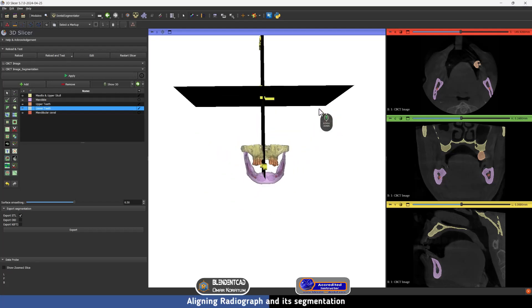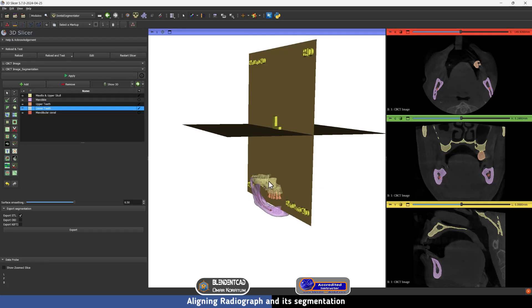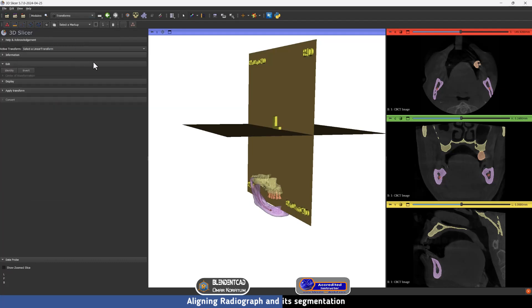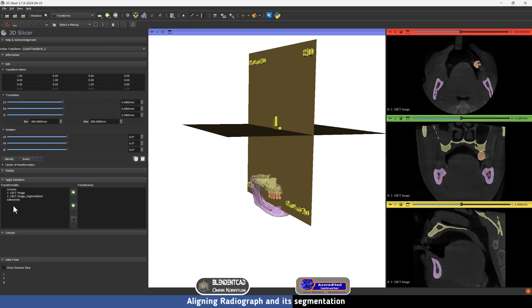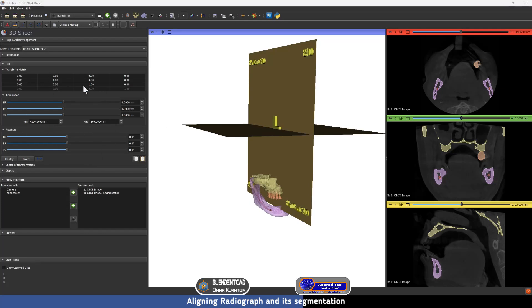Now I'm going to zoom out to see the location of the radiograph. As you can see, it's not at the center of Blender for Dental like we wanted. To move the radiograph and its segmentation, go to this dropdown menu and select Transforms. We are going to create a new linear transform by pressing this icon, then Create New. Here are all the objects in this project — we are going to add the data and its segmentation into the transform.